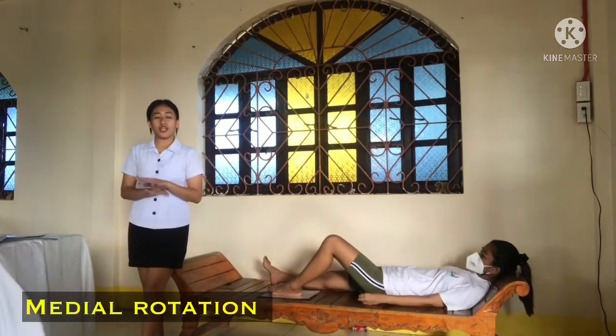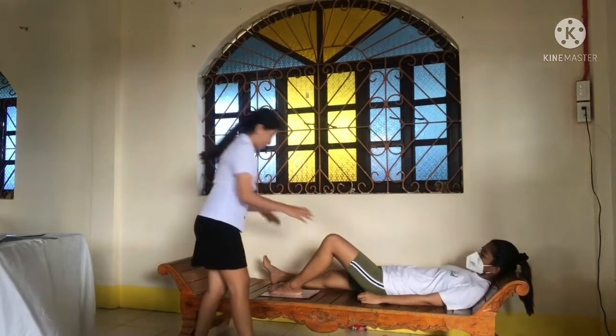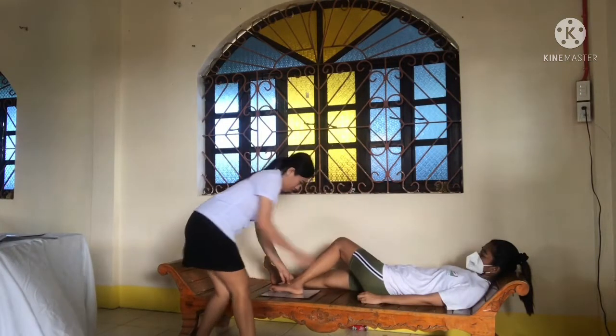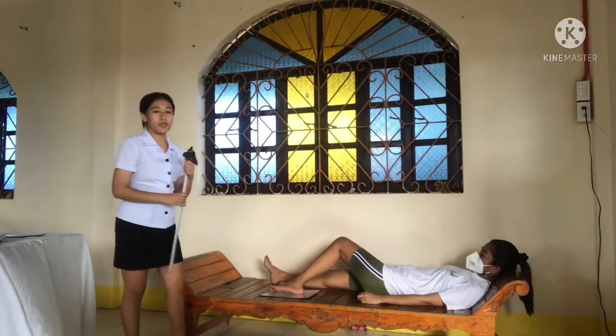For the medial rotation, place the IR under the patient's foot parallel with the long axis and center it to the midline of the base of the third metatarsal. And rotate the leg medially at the angle of 30 degrees. So, the central ray for this projection must be perpendicular to the base of the third metatarsal.